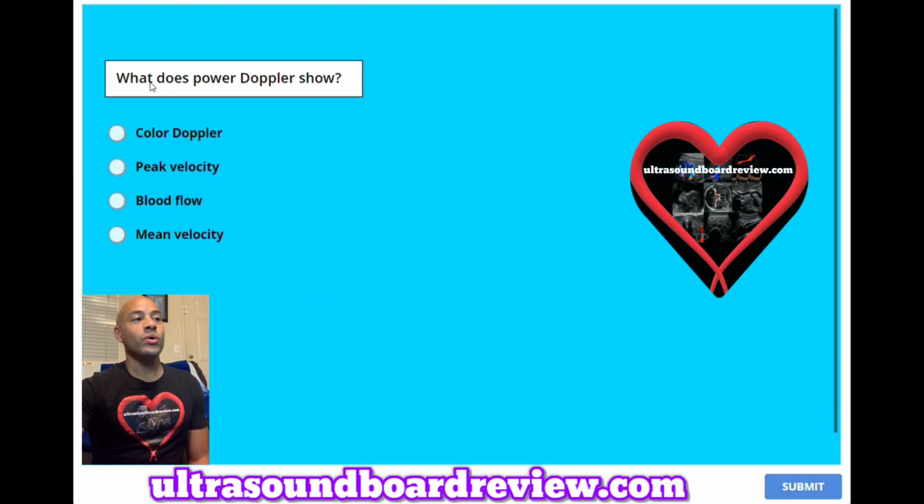Question 19. What does power Doppler show? A. Color Doppler, B. Peak velocity, C. Blood flow, or D. Mean velocity? The answer is C, blood flow.